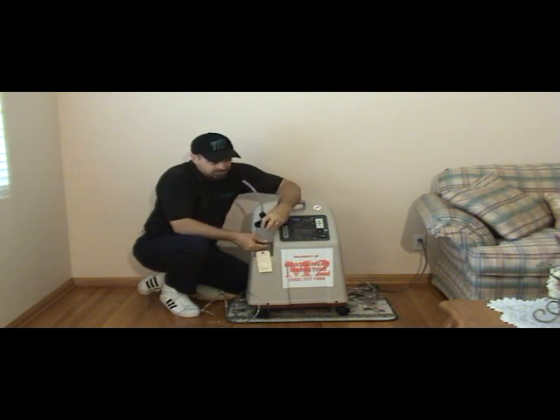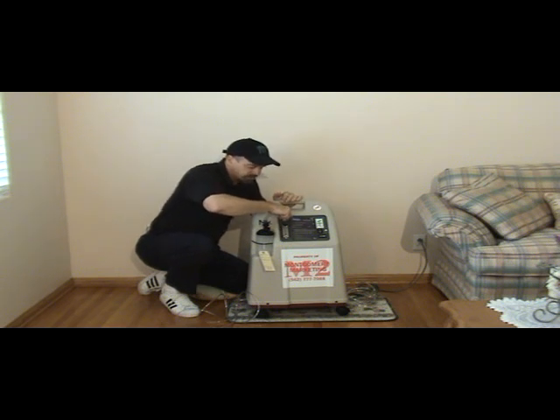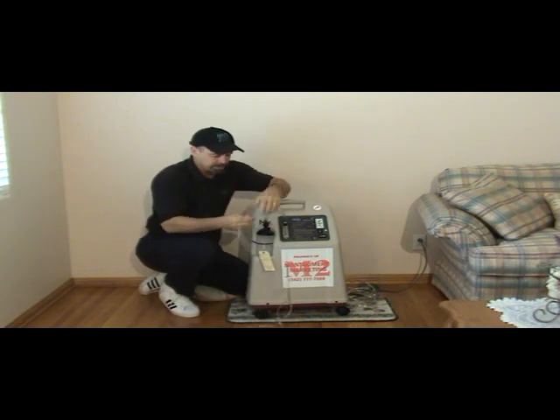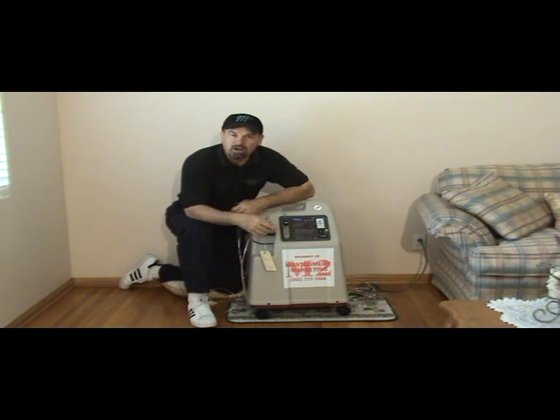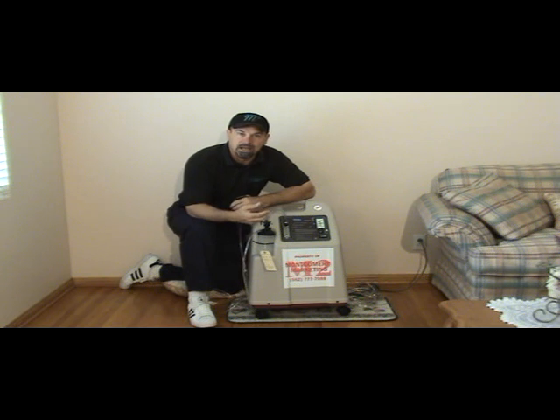So you fill this, now this sits in this holder, and then your tubing connects to where the nasal cannula used to be. Now on the face of the humidifier bottle, there's a nipple here that looks pretty much like the one from the concentrator. That's where you then hook up your nasal cannula or your mask, however you're going to provide it. When you do that with the unit on, it's going to look like the water is boiling, because the oxygen is going down and it's roiling the water, and then the little droplets of humidification are going through and adding moisture to the line. This will help alleviate some of the discomfort that patients feel when they're using oxygen, if they have discomfort around the nose area. Okay?